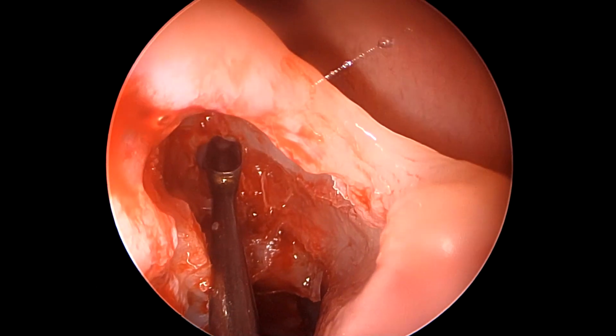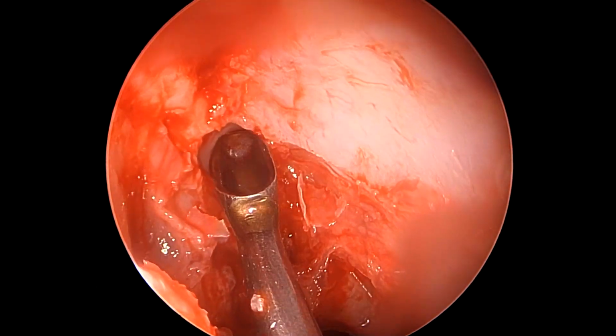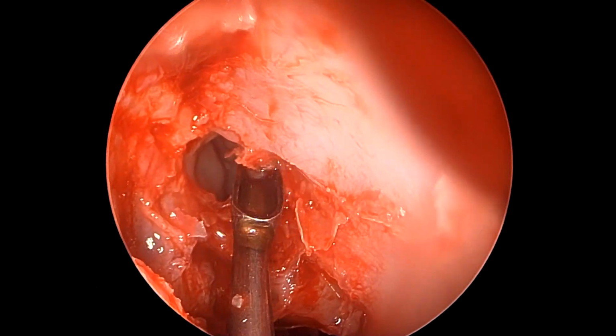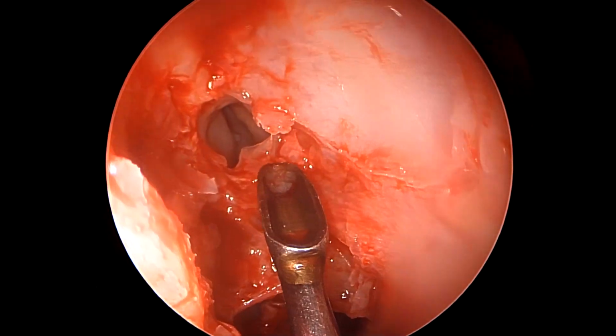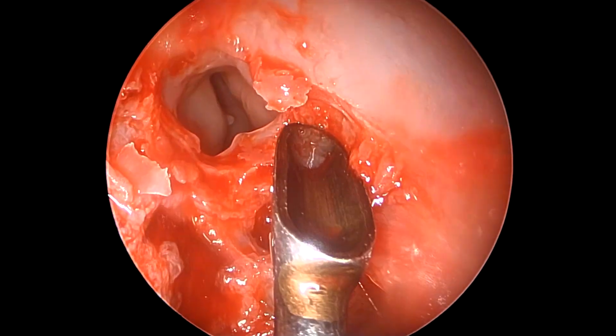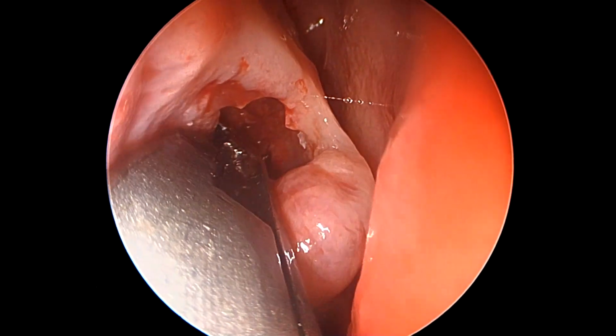As you can see, we are still working under the axilla of the middle turbinate, inferior to the frontal beak. We have not yet encountered the beak. And you can see a small cell having been opened as we are opening this cell with the curette. Now, as of now, we do not know whether this cell is the frontal sinus per se or not, and we will need more assurance about it.